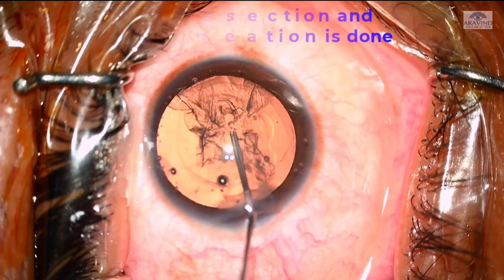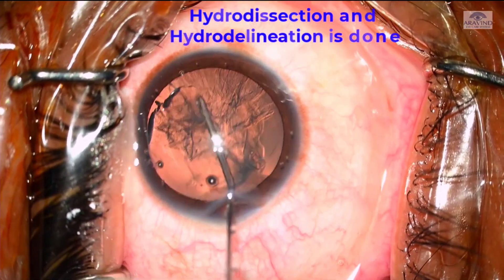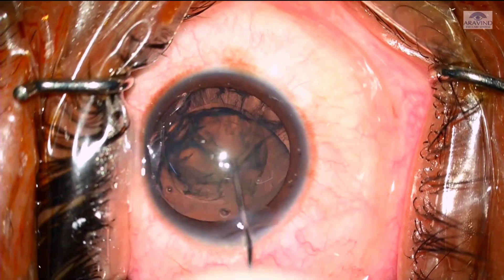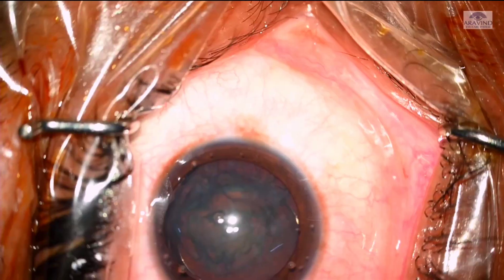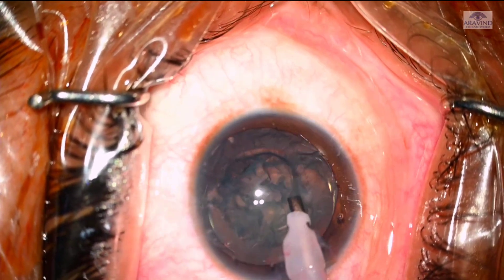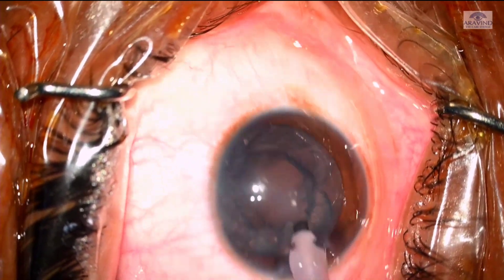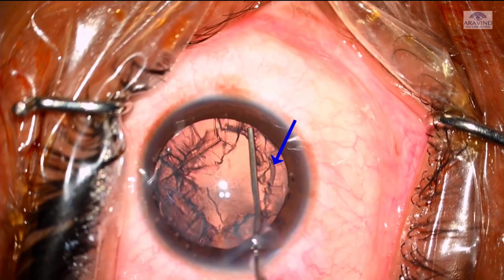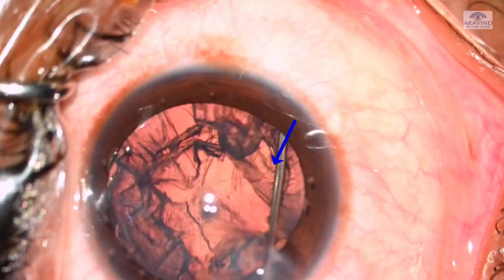Since it is a soft cataract, both hydrodissection and hydrodelineation are done. Viscoaspiration of the nucleus is done. A second hydrodissection is done to loosen the cortical matter, and the cortex remnants are aspirated.